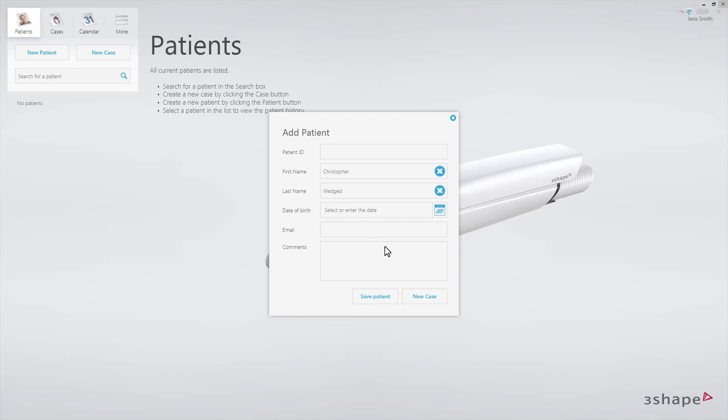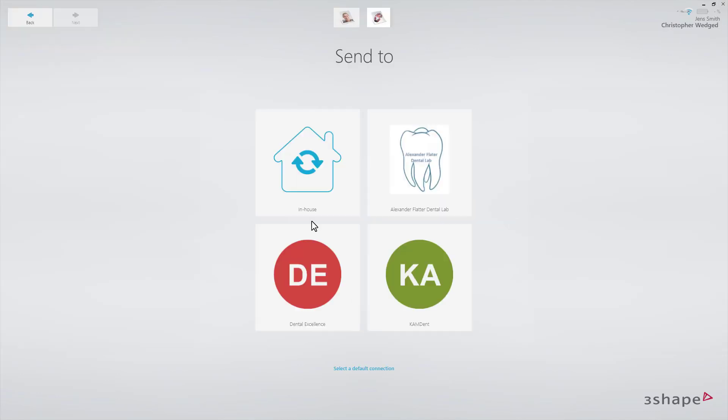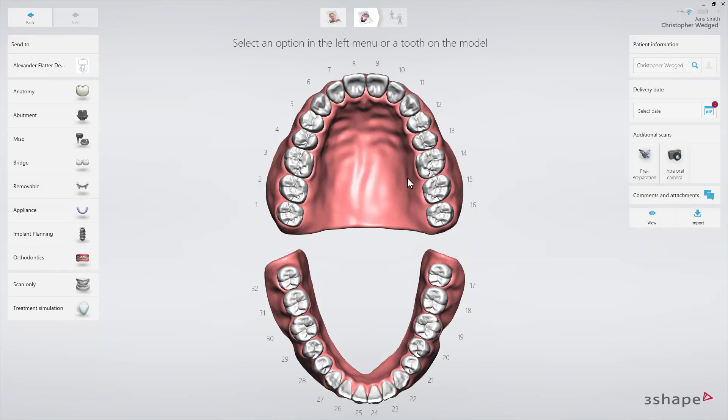Then select New Case. Select Lab. The order form will appear.